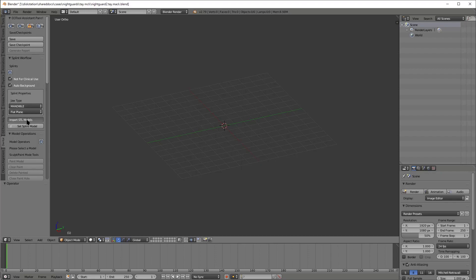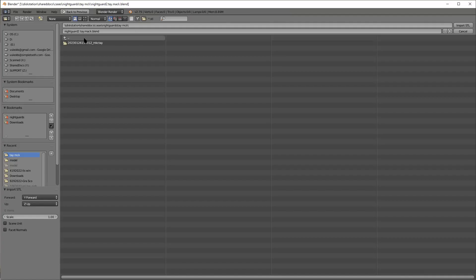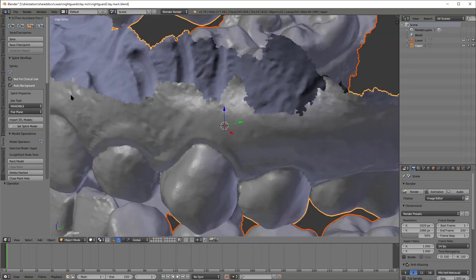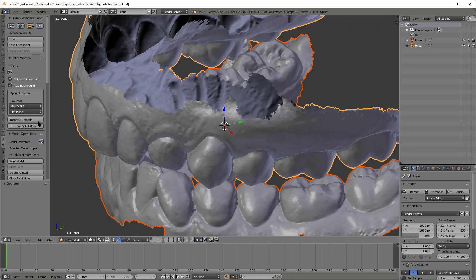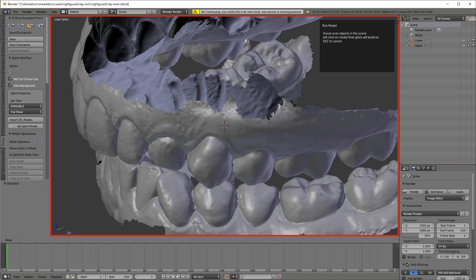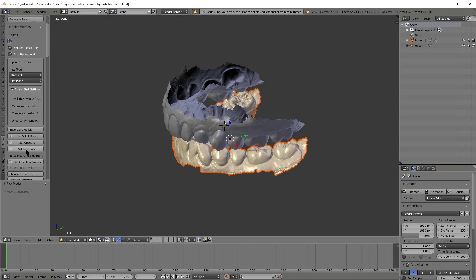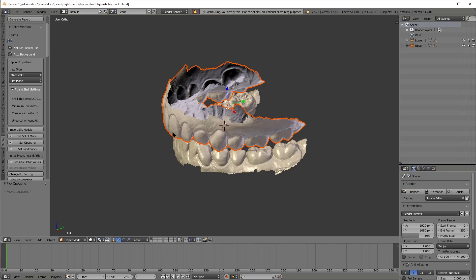I'm going to pick the type as a mandible, import my models. I use the shift key to select them both and then I hit import. Once they import, I'm going to immediately select the lower one. And then I'm going to go ahead and select the opposing one next.